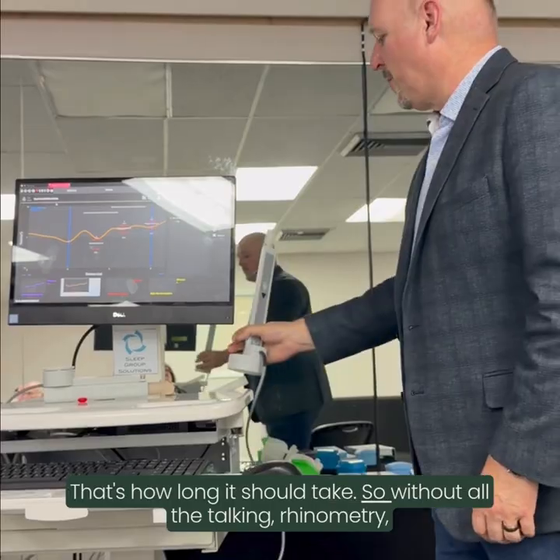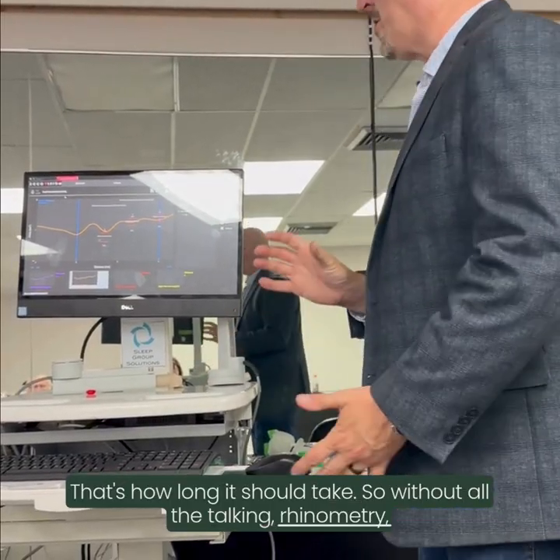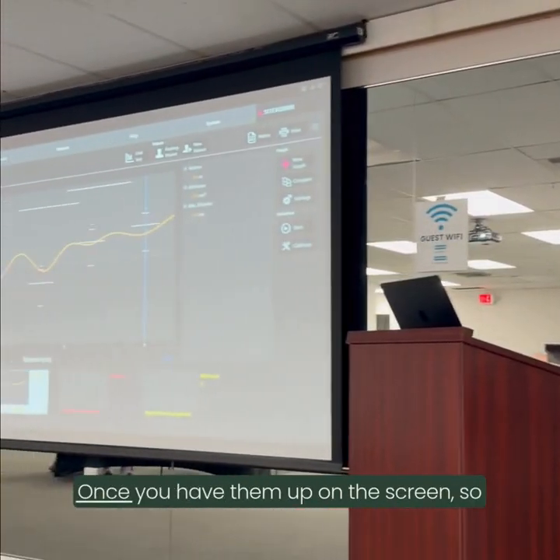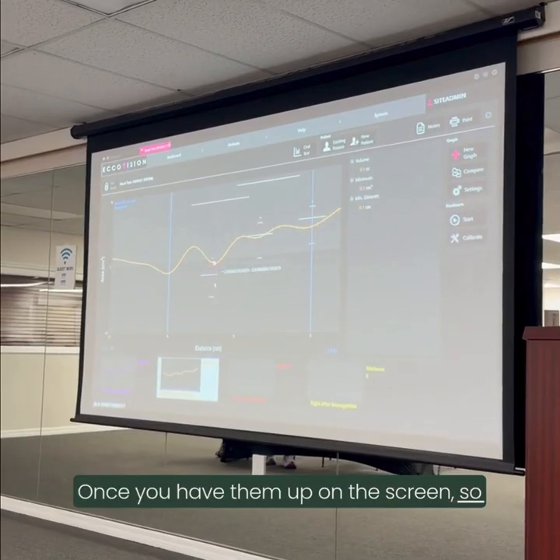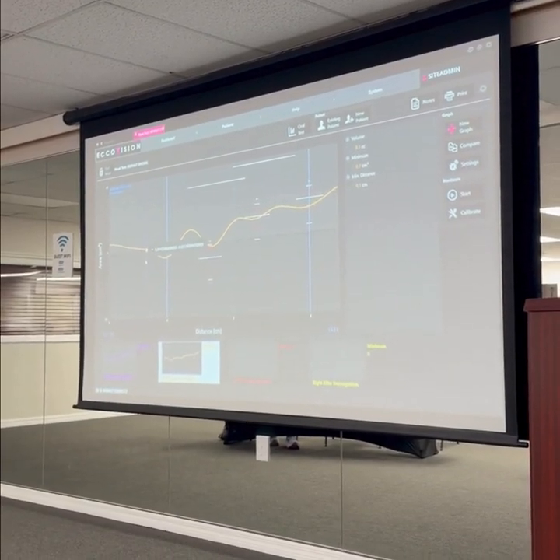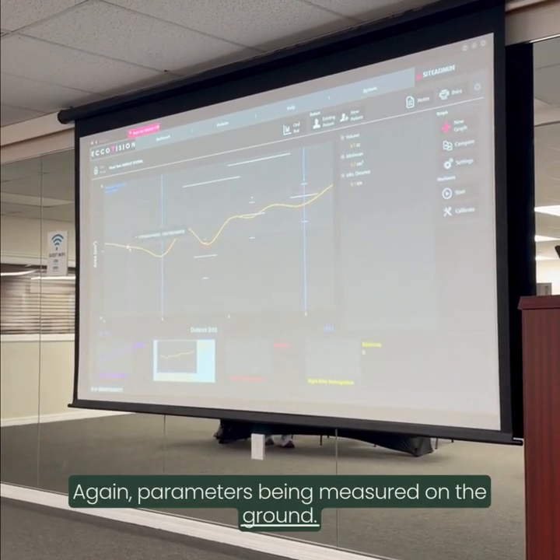That's how long it should take. So without all the talking, rhinometry, both sides, takes 30 seconds. Once you have them up on the screen, now we have two readings. Again, the parameters being measured on the graph are two things.